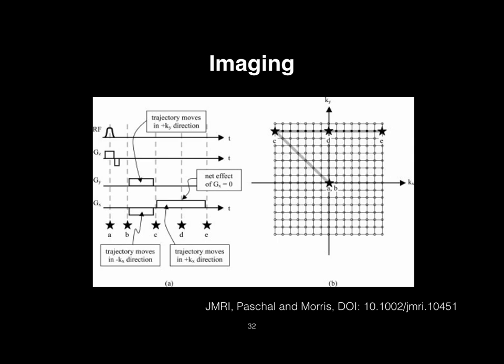We don't have it on our newest scanners right now because we need to buy some interface equipment to replicate that. But if you look at what the waveforms are doing, this is essentially drawing out how it's creating and walking through k-space. Okay. So what k-space represents mathematically is essentially the time integral of the area of the gradients. Okay. So let's walk through these 5 points here pictorially with this really simple experiment.